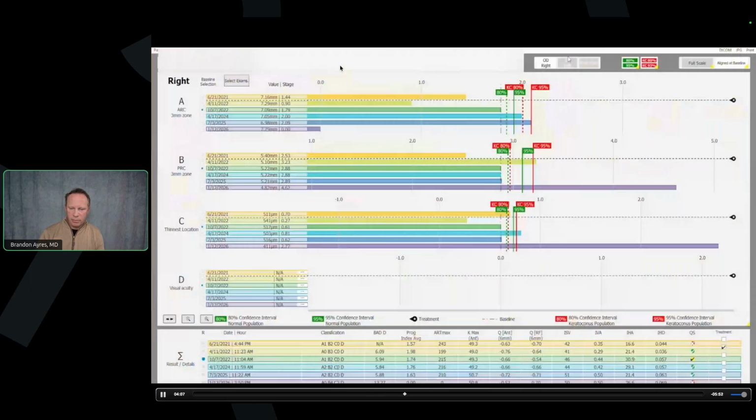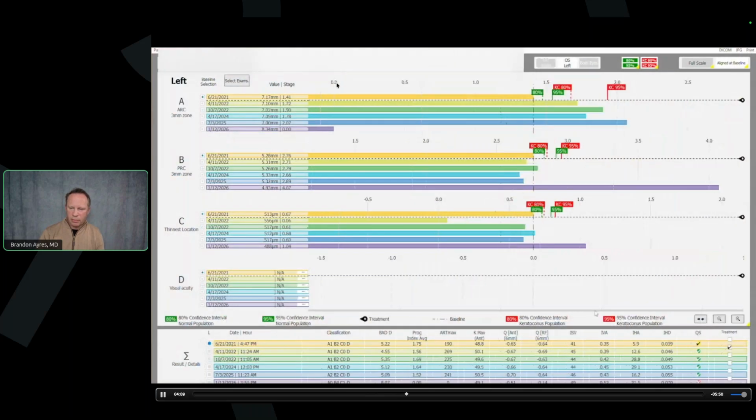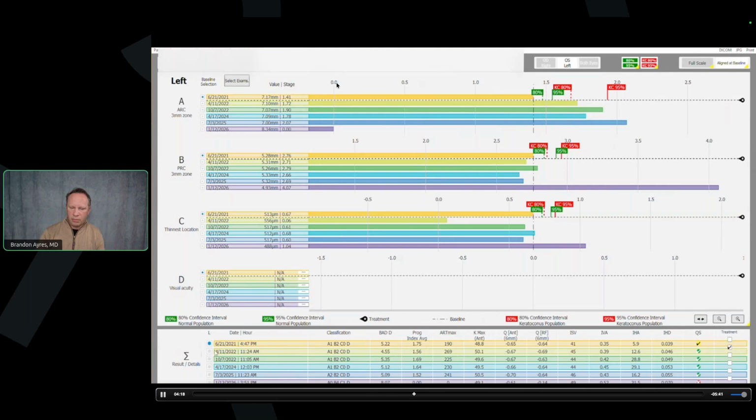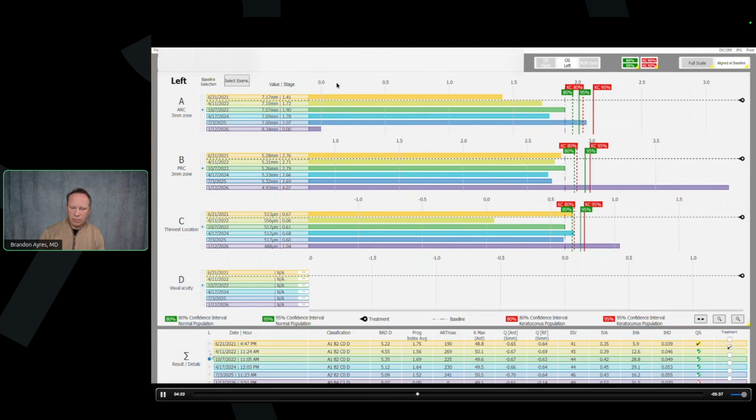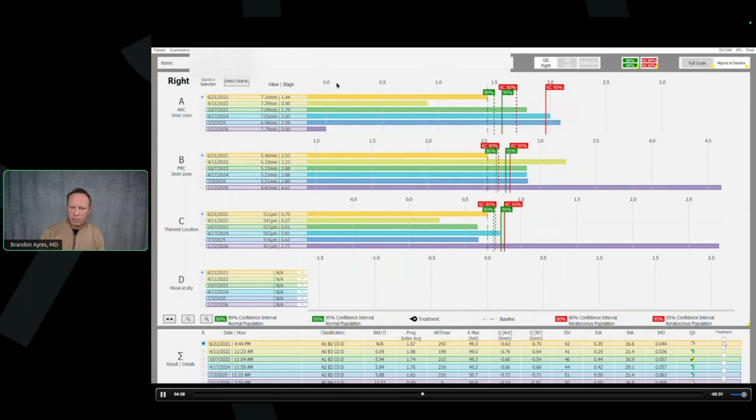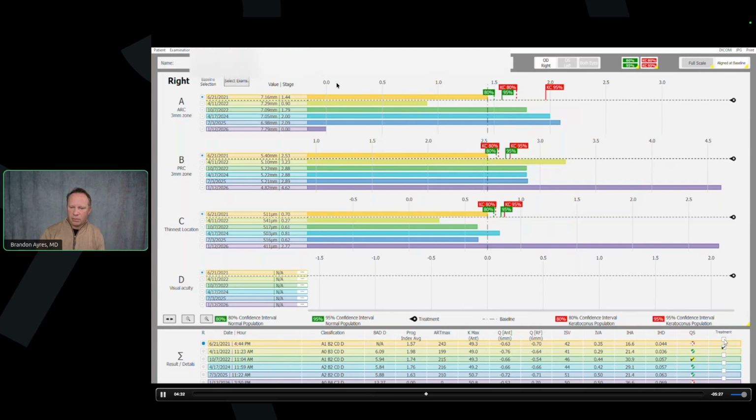But on the bottom part of this screen, you can see all the exams kind of lined up, right? And what you can do, and this is actually a slightly older version of the software, the newer version, you can actually input the actual date for cross-linking. But I'm going to uncheck where we did his cross-linking. So you can see when we do that on the screen, that little black bar is gone.